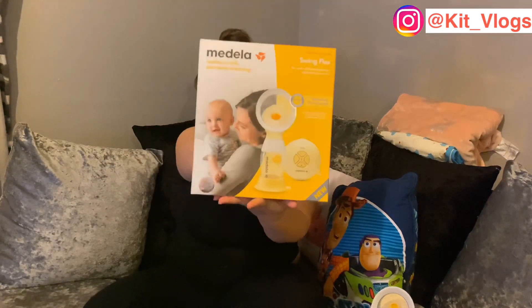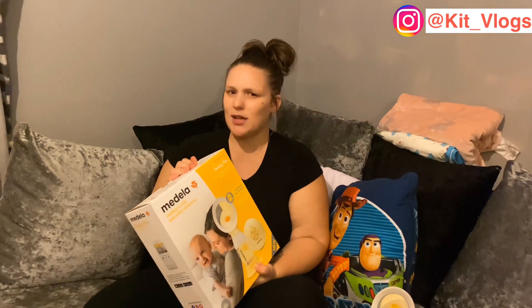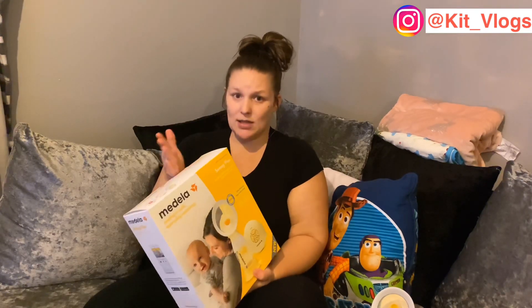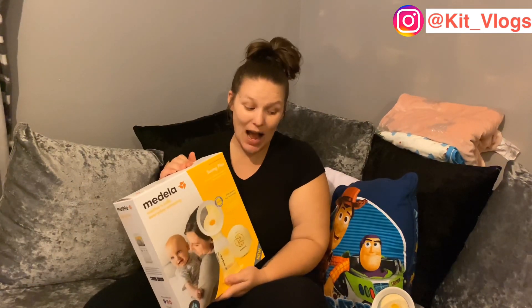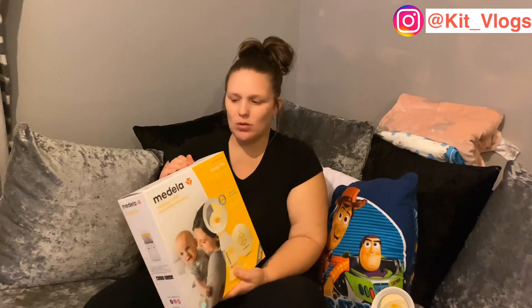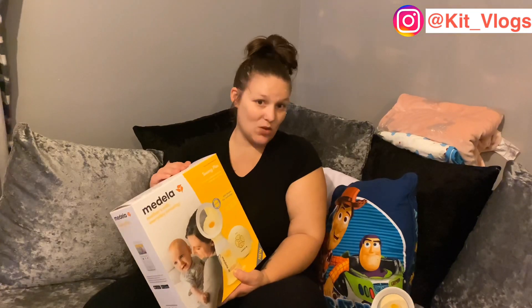Value for money: this breast pump cost £139.99 and Kurt got it from Boots because we needed it ASAP to get Emily's weight in check. I think it's worth every single penny. I get a really good amount of milk out of it, and if I need to top her up you can buy other bits for it, and it's not that expensive to get the other pieces.